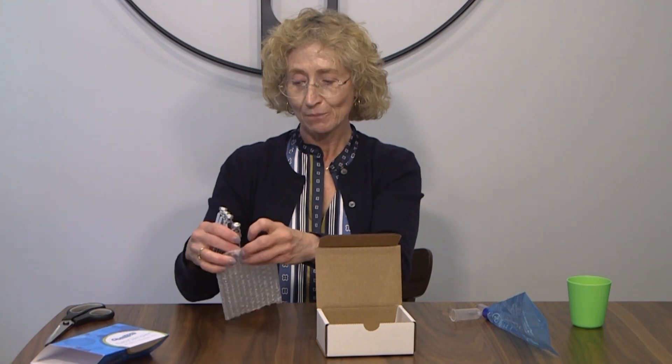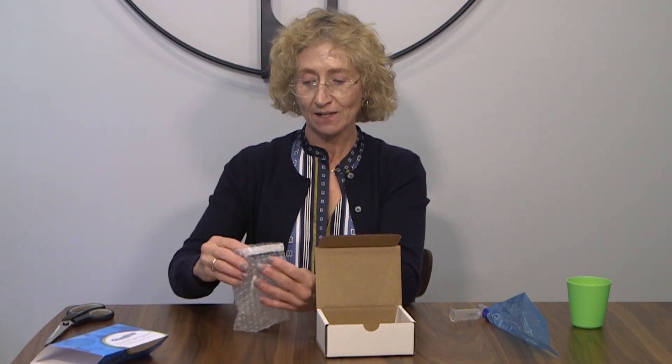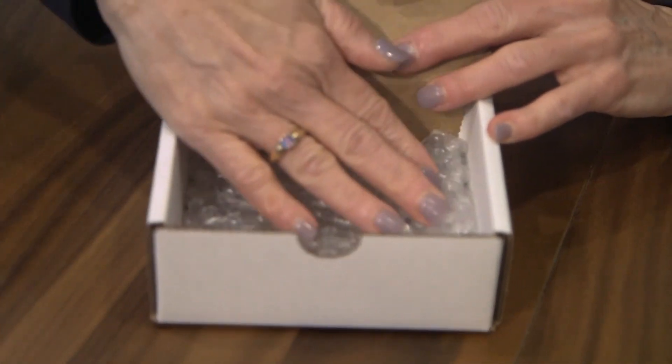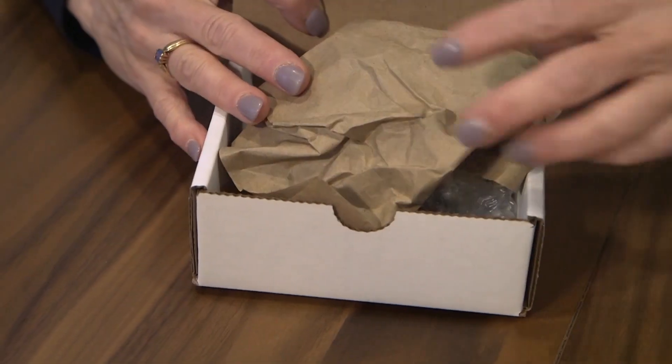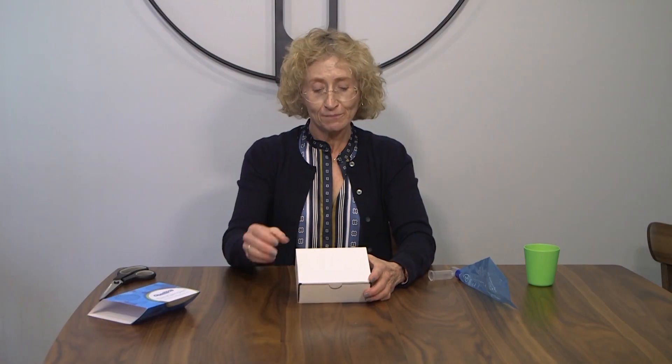After the four samples have been collected, make sure they're marked and labeled with the time, the date, and the name. Put them in the bubble wrap packaging that comes with the kit. Seal that up, put it back in the box. Put some newspaper in there to prevent it from breaking. Seal the box up, tape it up, put the address label on it as well as the stamps, and you can drop it in the post office back to our clinic. Within a week of getting the samples at our office, we will get back to you with the results.